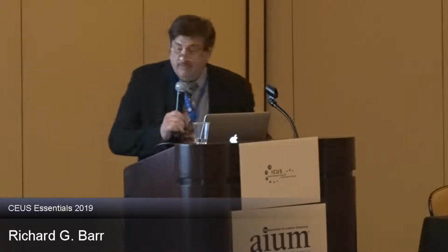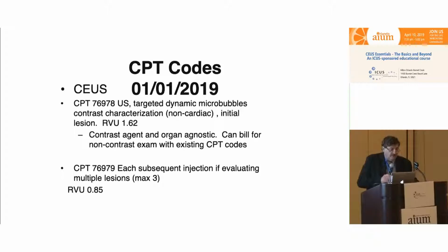So actually, Yuko is going to do this, so I'm using most of her slides. We do have a new CPT code as of January 1st this year, and for ultrasound, the CPT code is 76978, ultrasound, targeted microbubbles, contrast characterization, non-cardiac initial lesion with an RVU of 1.62.